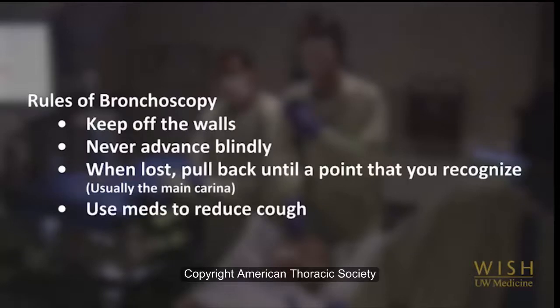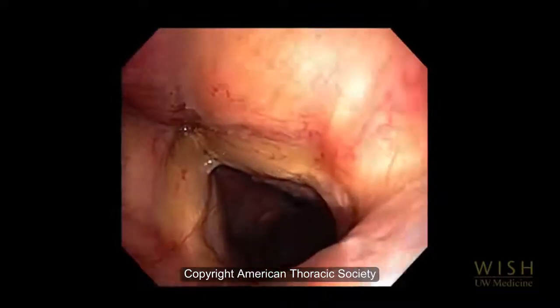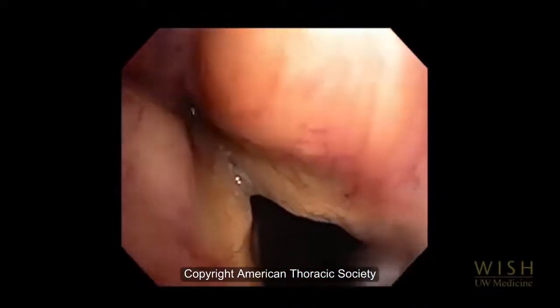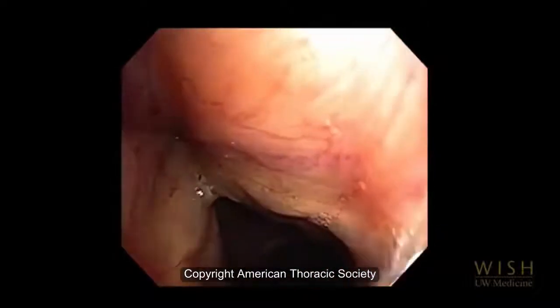As a general rule, you should give a dose of lidocaine prior to entering the trachea and at any carina before advancing past it, as these areas are prone to causing cough. Then wait a few seconds before advancing for the lidocaine to take effect. Initial entry of the trachea often causes significant cough, so most bronchoscopists administer a dose of lidocaine into the trachea once they pass through the vocal cords. If cough is severe, the patient may need more topical anesthesia or more fentanyl or both.